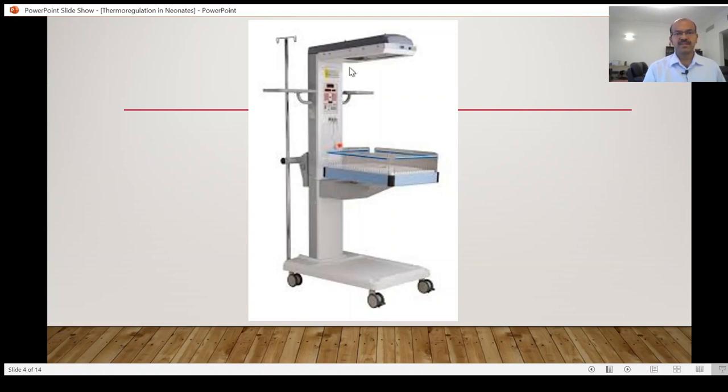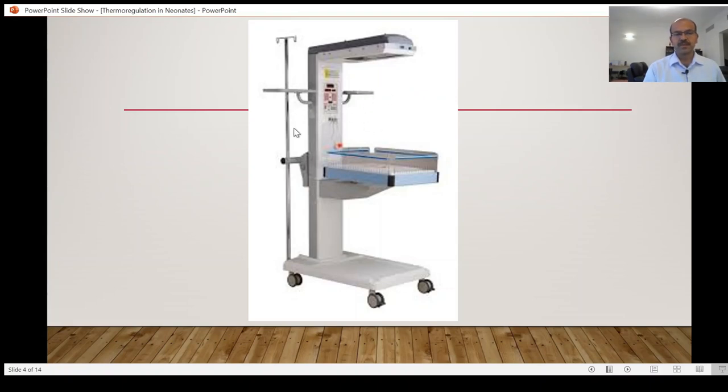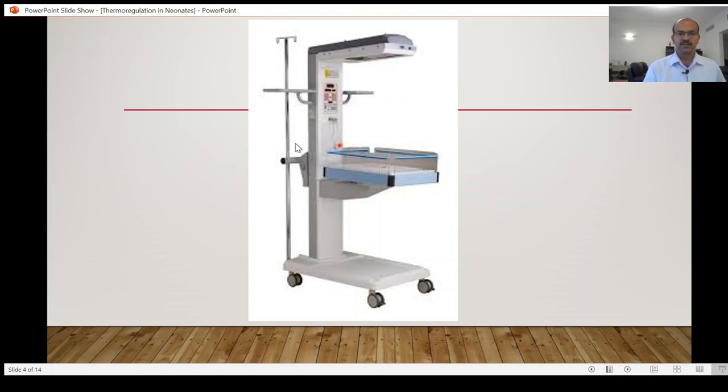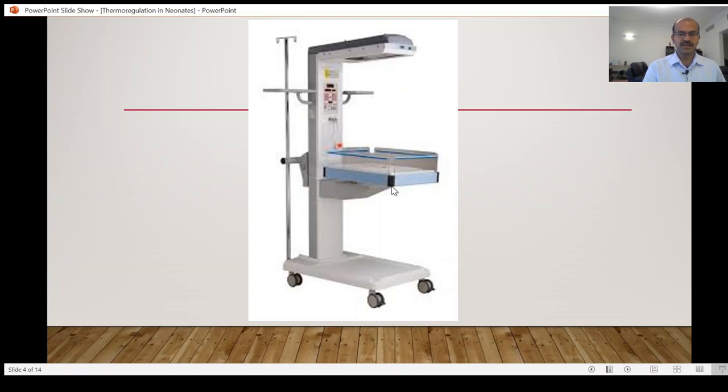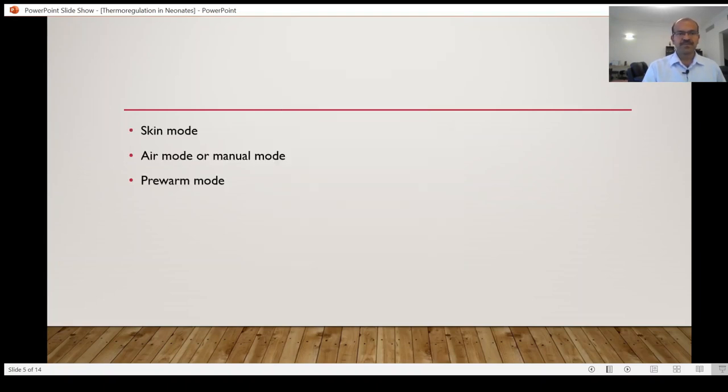So this is the open care system. As you can see, we have the radiant heater at the top. You may have the resuscitative air options in the open care systems, mainly those used in the labor room, but those used in the NICU you may or may not enable them as you will have a number of other devices attached. These side rails are very important. Don't forget to close them. There is an ability to tilt the system as well and lower the unit up and down.